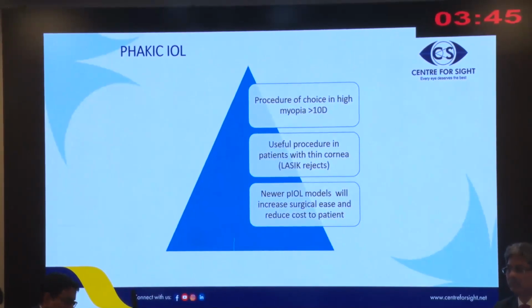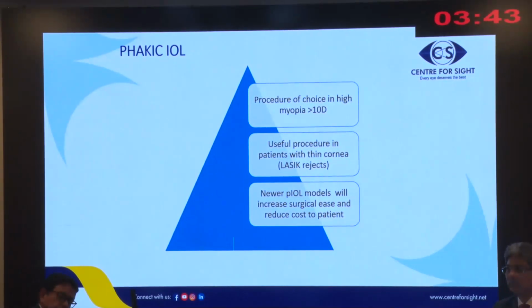You can have endophthalmitis in particular cases, because it's an intraocular procedure. All the asepsis has to be done. There can be problems: when we started doing a surgical iridotomy, I made a CI instead of a PI. So there were a lot of complications, but it's been a learning curve. One important thing is, if you learn the process, it's a good, simple process.